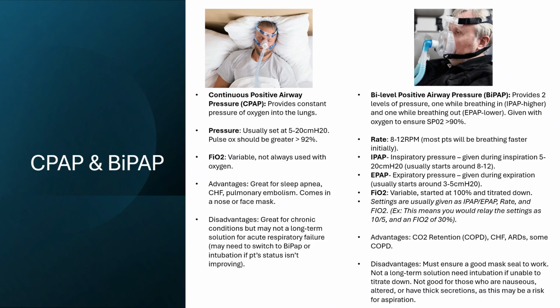This is good for patients in heart failure, acute respiratory distress, and then, like I said, some COPDs, but you just got to be very careful with that. Disadvantages: you have to make sure that there's a good mask seal for this thing to work. If there's not a good mask seal, you're going to be hearing alarms till the cows come home. So you got to make sure that there's a good seal.